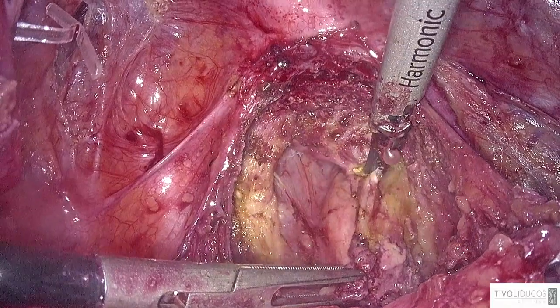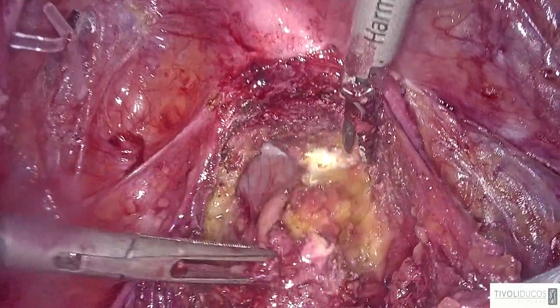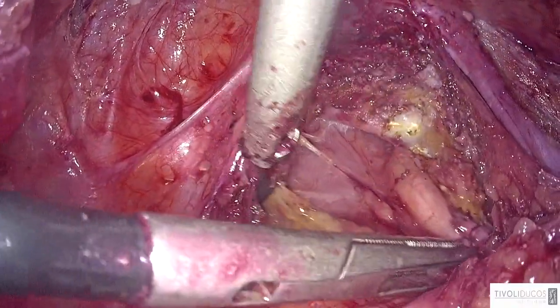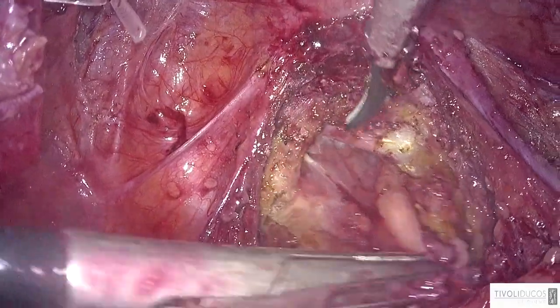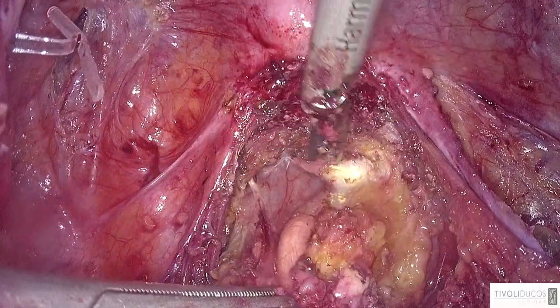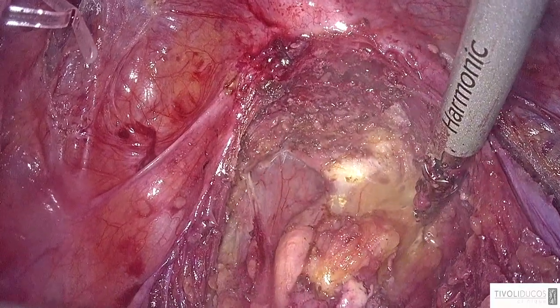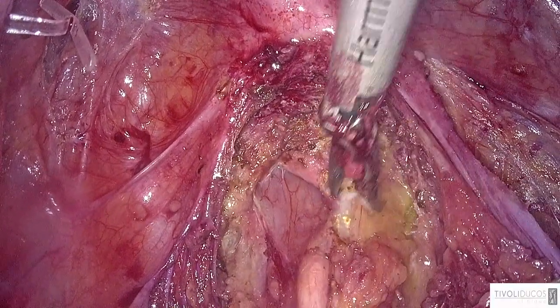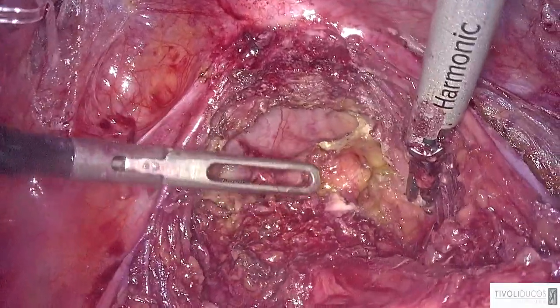It's wonderful. Yeah, we are watching. But it is my technique. I have done several hundred, honestly. So, for a long time I was going on the lateral side, and now I keep an eye on the lateral side, and I try not to go farther on the midline than on the lateral side. So each time I cut here, I have already done it laterally, and I have a look on the lateral side. So I think it would not be prudent to cut only on the midline, and it is much more safe to do from the lateral side, as you emphasized.